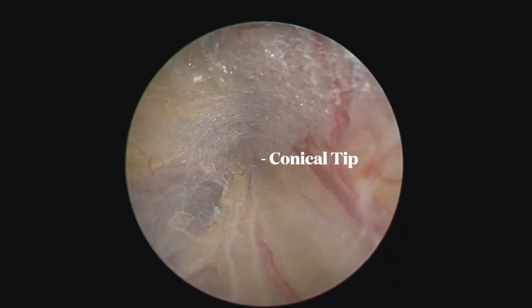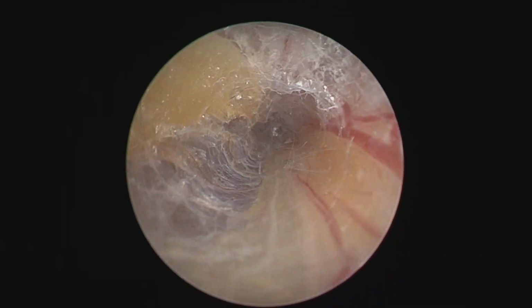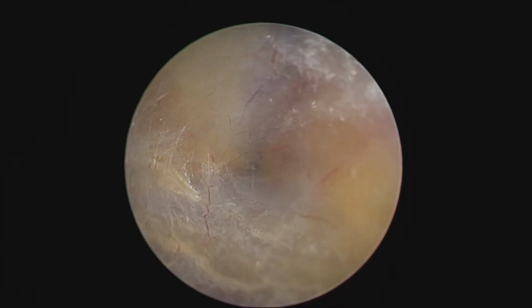Here you can see where the conical tip is in relationship to the vein and all the adventitia intact. Careful dissection using this technique will reduce potential damage to the wall of the vein and the intima.